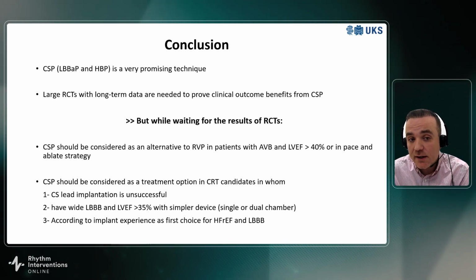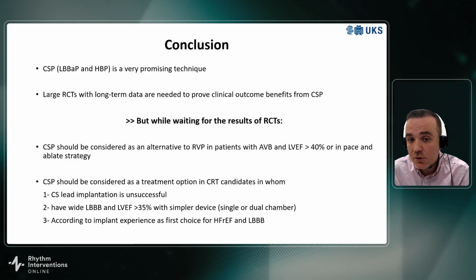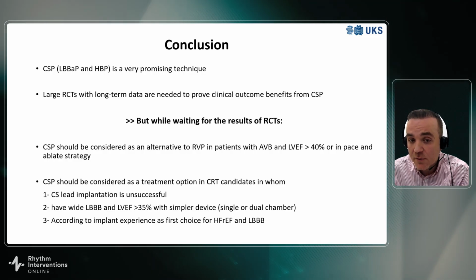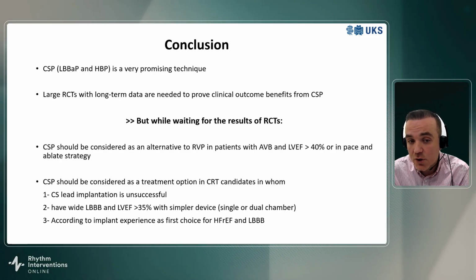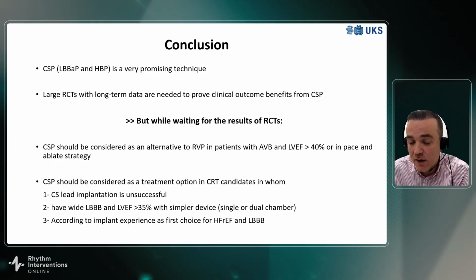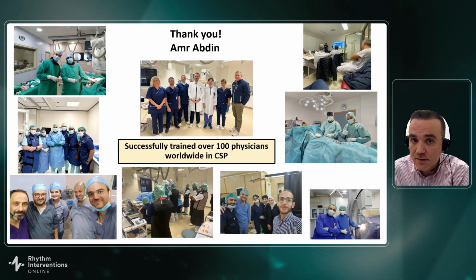Talking about heart failure indication, CSP should be considered as a treatment option in patients with failed CS implantation, with wide left bundle branch block and LV function above 35% with simpler device, so single or dual chamber, or according to implant experience as a first choice for HFrEF and left bundle branch block patients.